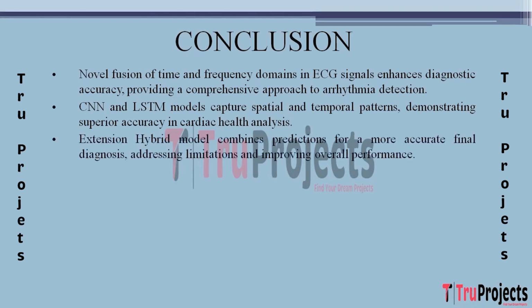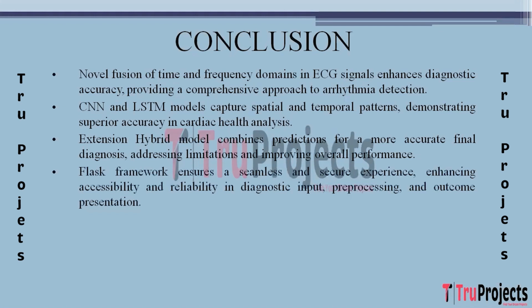The extension of the project includes the development of a hybrid model combining predictions from multiple individual models. This ensemble approach contributes to a more robust and accurate final prediction, addressing potential limitations of individual models and enhancing overall performance. And the integration of a Flask framework provides a user-friendly interface for seamless input processing and presentation of diagnostic outcomes. The inclusion of SQLite for sign-up and sign-in ensures secure user authentication, enhancing the reliability and accessibility of the developed system.